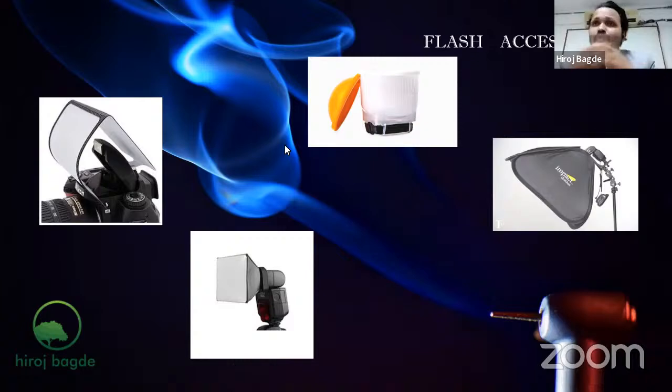So we have something called a pop-up flash diffuser. We have something called a lambent diffuser. Now this is the lambent diffuser, which has a round shape. I will attach this kind of diffuser to the speed light, in this area. Now whatever light will come, it will be diffused in a circular pattern. Can you see this circle?